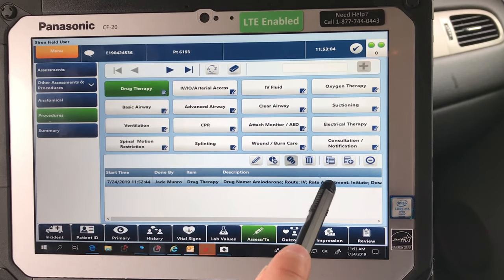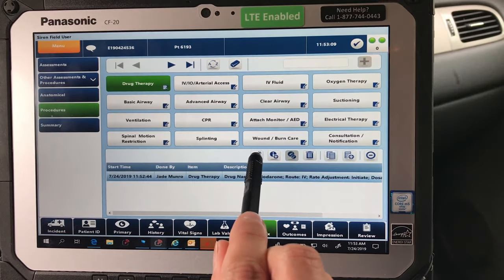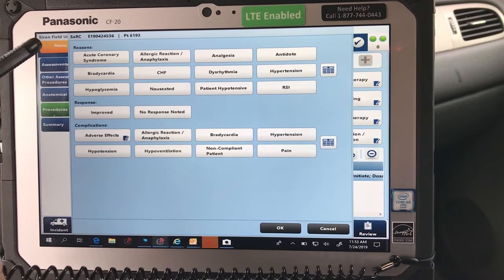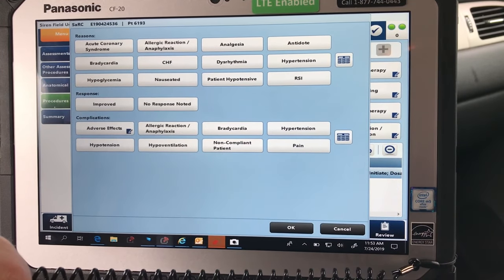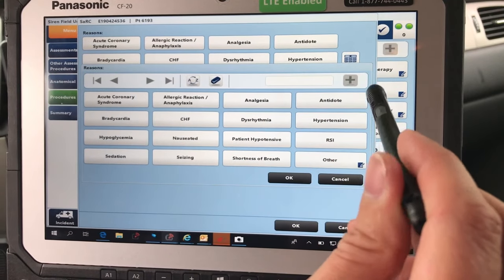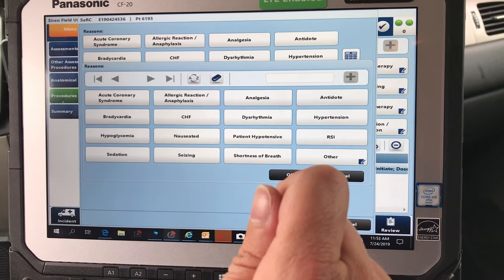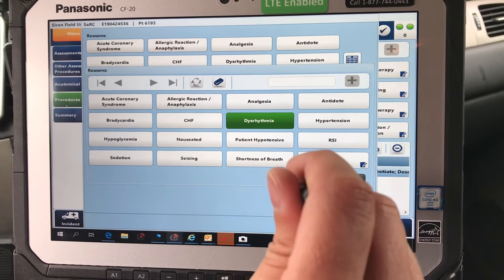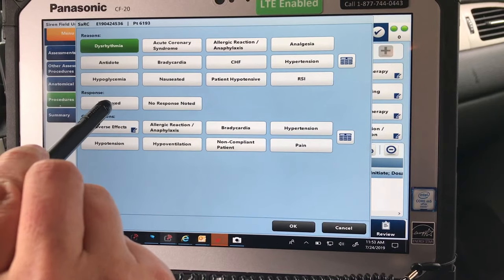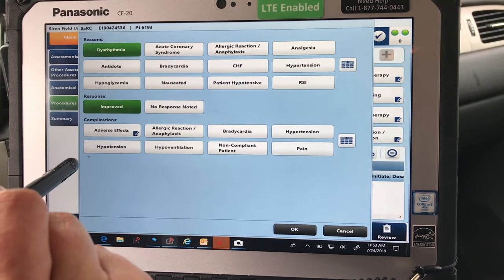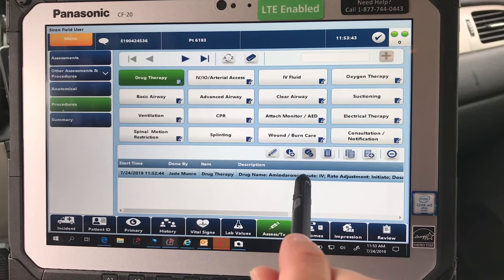Once you've entered a drug or a procedure and you want to sark it — meaning give a reason for why you gave it — for example, if I gave amiodarone as an antiarrhythmic, first find it. Select Dysrhythmia. Say I gave 300mg of amiodarone in a cardiac arrest and got pulses back — I would select Improved, and no complications. That means your drug has been sarked.